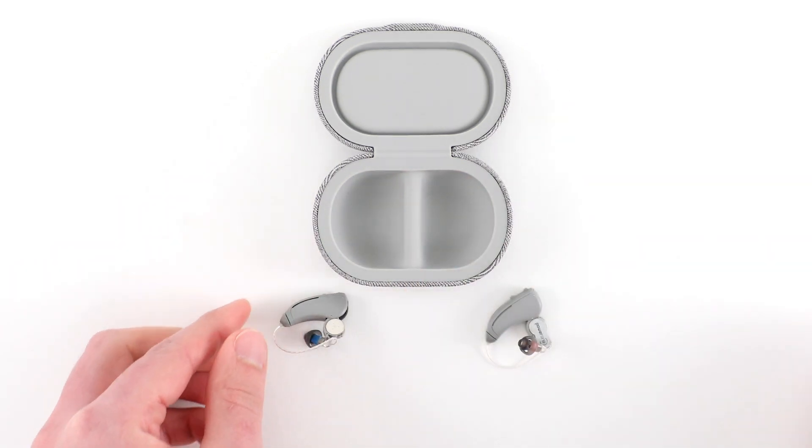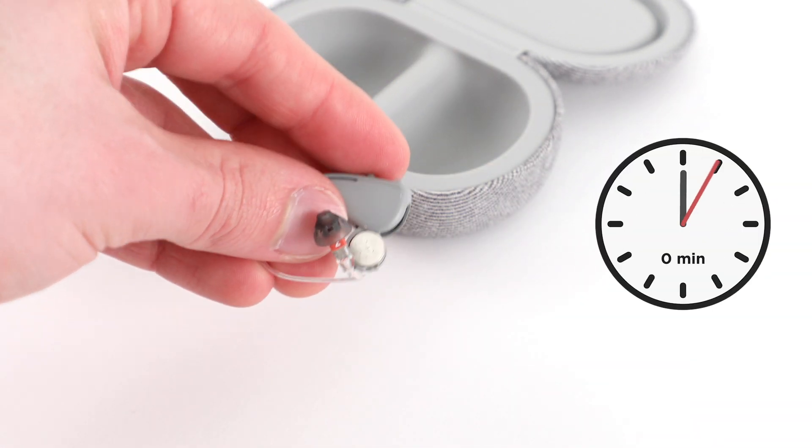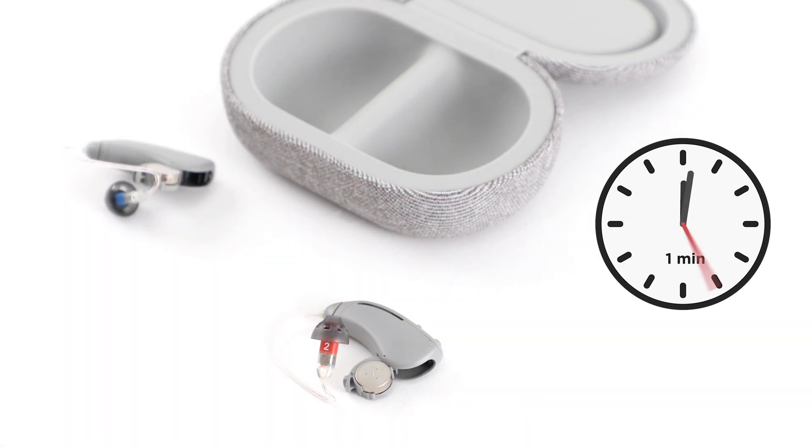Peel the sticker off to activate the battery. To extend the battery life, leave the battery in with the door open for five minutes. This exposes it to the air and gives it time to fully activate.